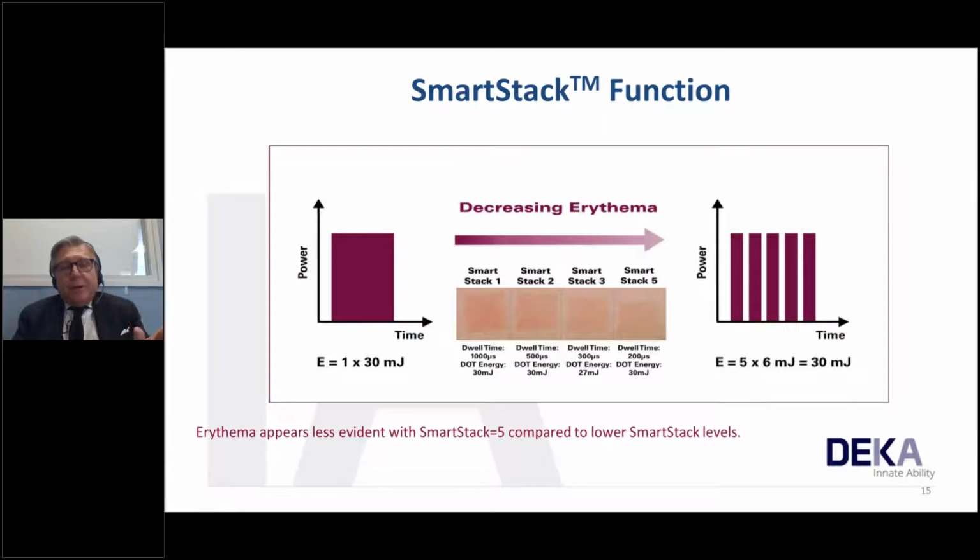You see the comparison between stack 1 and stack 5. We can get the same total energy, in this case 30 millijoules, but reducing the erythema of the skin, while getting the same results. So it's a safer modality to have the results.